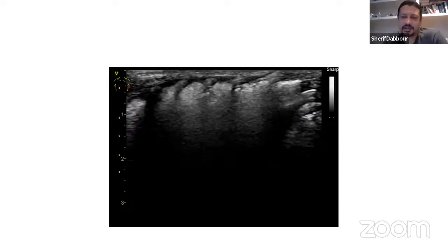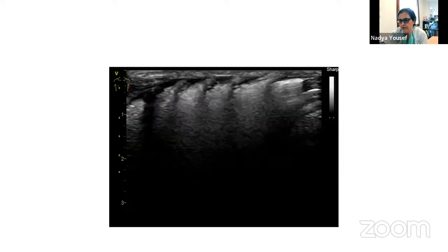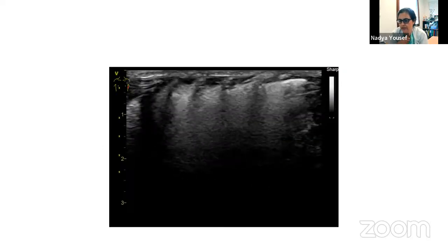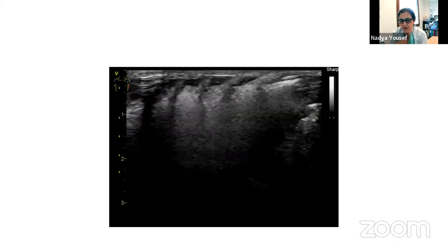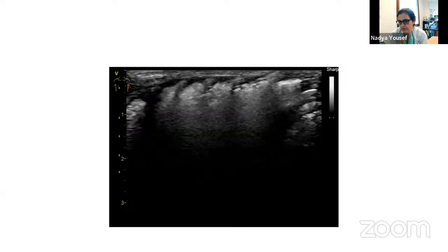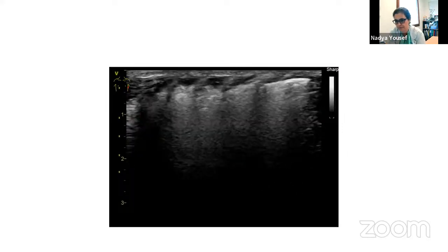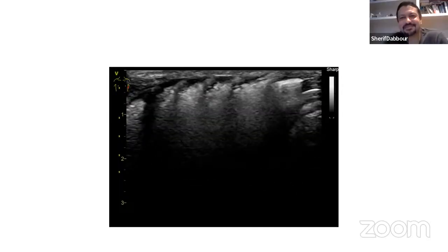Like evolving chronic lung disease. Yeah, well, this lung hasn't cleared up after surfactant. We're still seeing almost the same, I would guess, that we saw in the beginning. So this is the lung that has not been aerated. And you wouldn't think that's just because this baby was extubated, because it's not the picture we're seeing. We're seeing exactly what it looks like in RDS. So I agree with you. It's just that at 10 days, you wouldn't give that diagnosis. Yes. Yeah. Thank you very much. Appreciate it. Thank you.